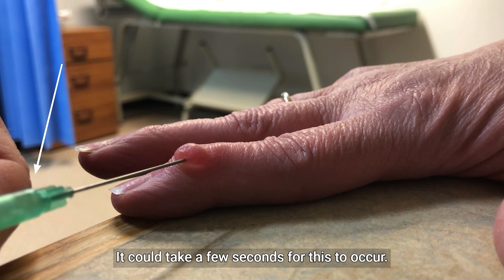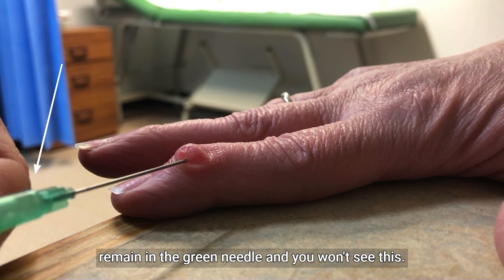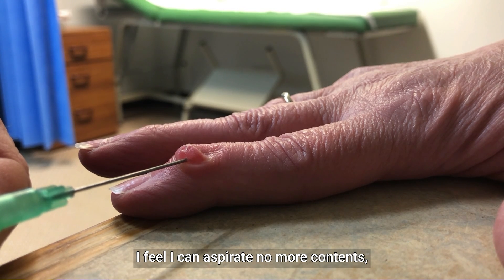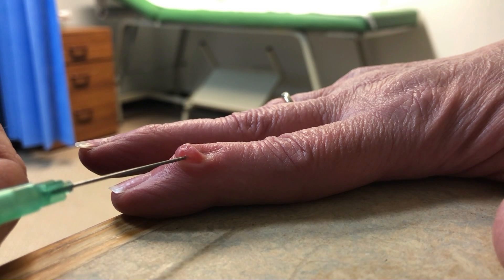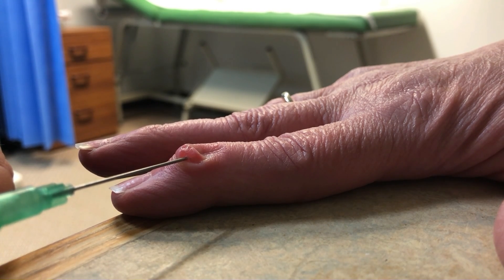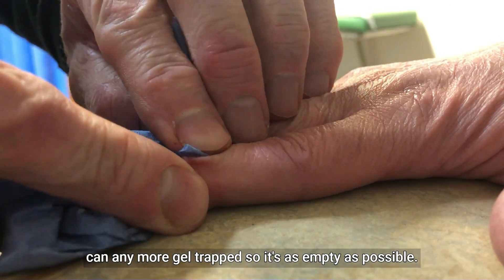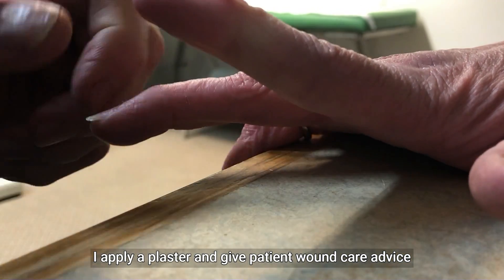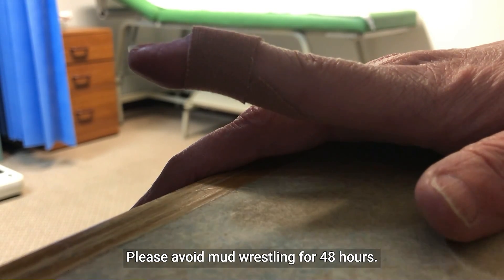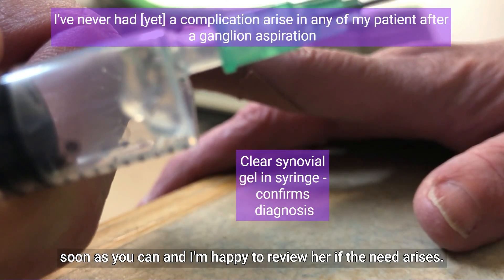I keep the syringe barrel still and avoid pulling the needle out while applying suction. Watch for bubbles of gel appearing in the needle — it can take a few seconds. If the ganglion is very small, all the gel may remain in the needle and you won't see this. I continue aspirating as the ganglion deflates until I can aspirate no more. I then use a tissue to gently express any remaining gel so it's as empty as possible. I apply a plaster and give aftercare advice: keep it dry for 12 hours, avoid soaking it, avoid mud wrestling for 48 hours, and contact me with any concerns about infection or redness.